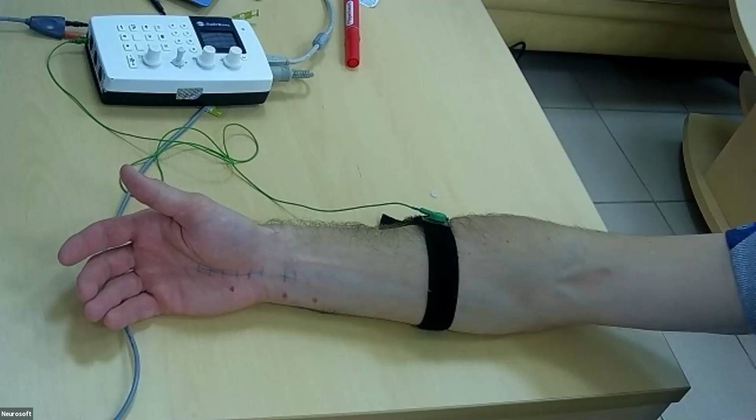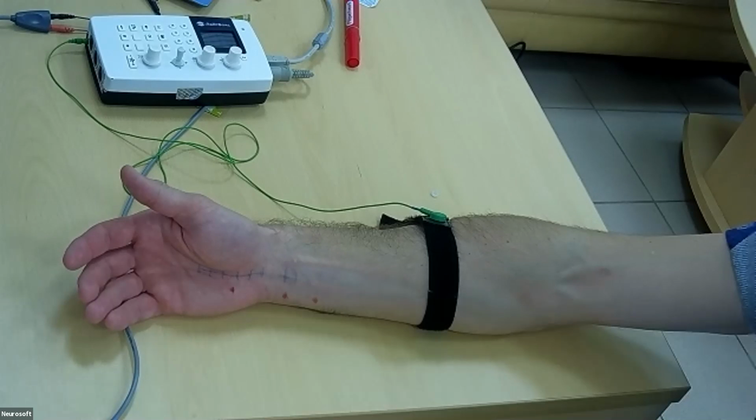sensory inching method. For this, we will use ring electrodes.